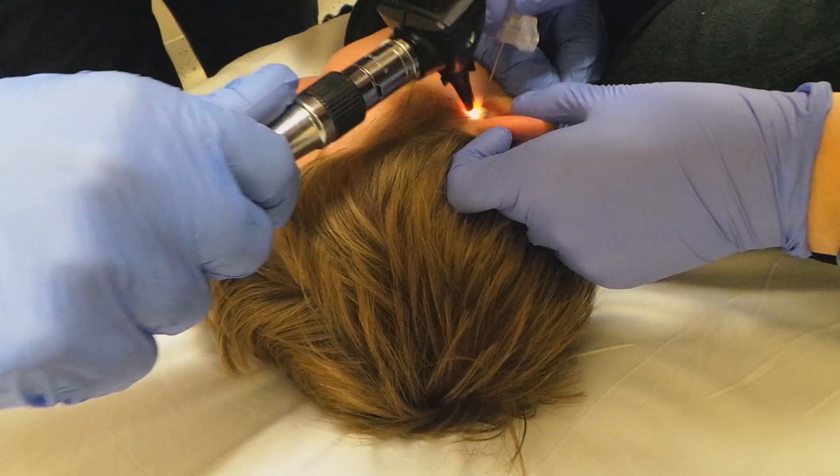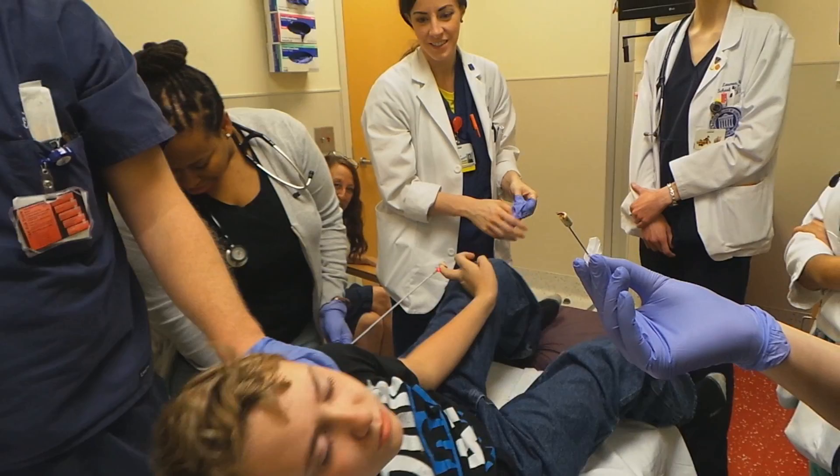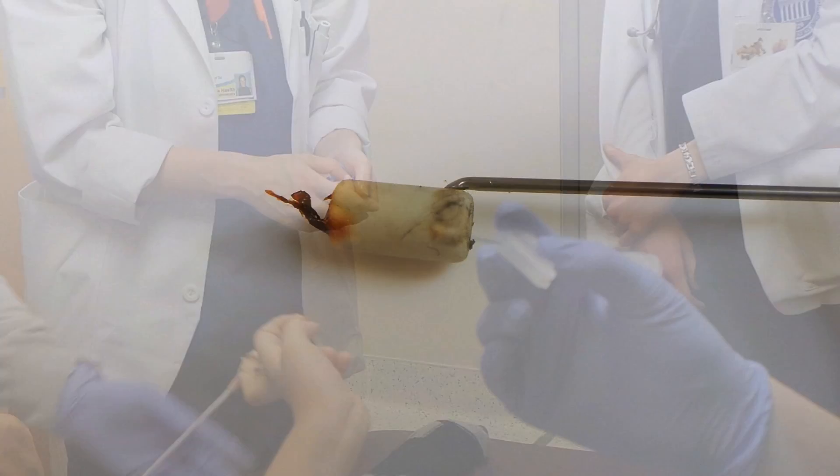There we go. Let's see it. Now that was very smooth — that was very smooth. Can we take a look just to see? I think that's our earwax too. It'll blow up a little bit. No, that's not blood. Can I look in your ear, buddy? I just want to make sure we got everything. I don't feel nothing. No, you shouldn't — let me take a look.